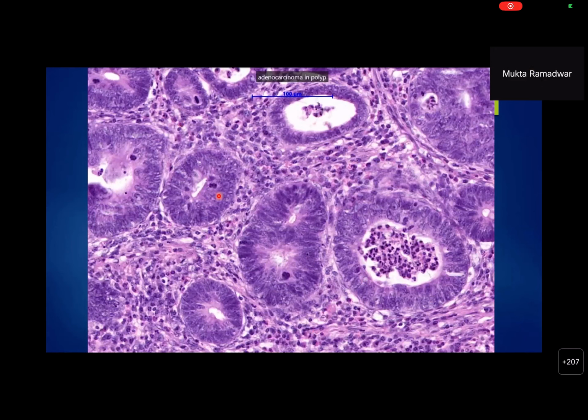Okay. Yes, ma'am. And you see hardly any cytoplasm because the nuclei are becoming so big, they are occupying most of the cell. And they are no longer pencil-shaped, elongated, but they are getting rounded. And paradoxically, because of chromatin clumping, many of these nuclei are looking empty. And that is the meaning of the word vesicular. A vesicle is a bulb, right? Which is an empty bulb. These are paradoxically looking empty because the chromatin is getting clumped. Because as the degree of dysplasia increases, the chromatin amount increases and it clumps.